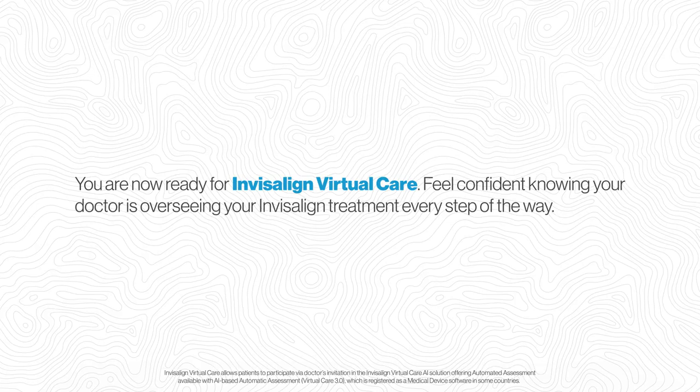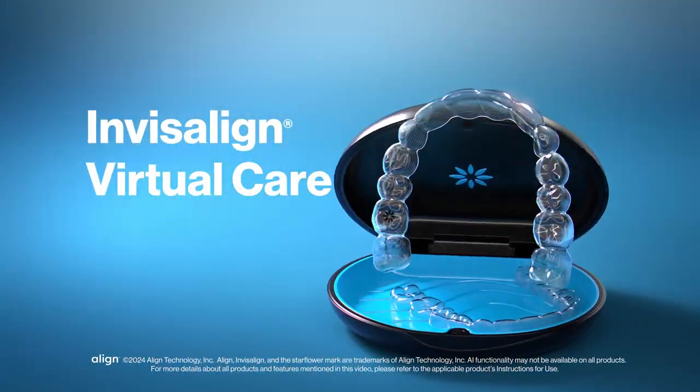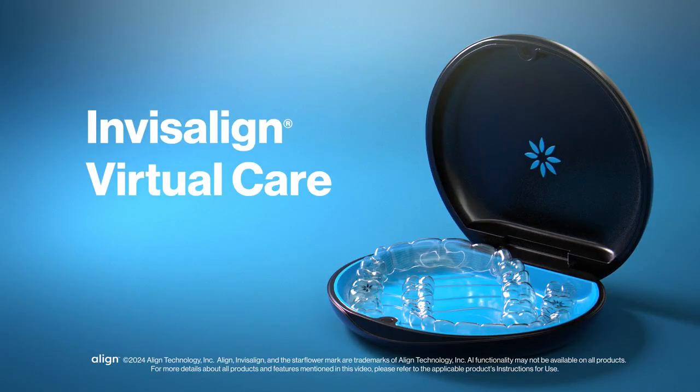You are now ready for Invisalign virtual care. Feel confident knowing your doctor is overseeing your Invisalign treatment every step of the way. Congratulations on taking another step on your journey to a new smile.